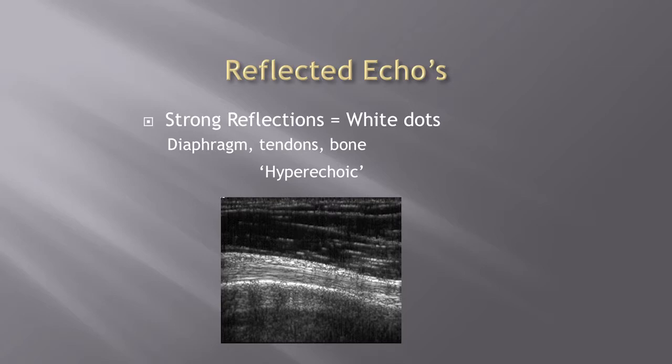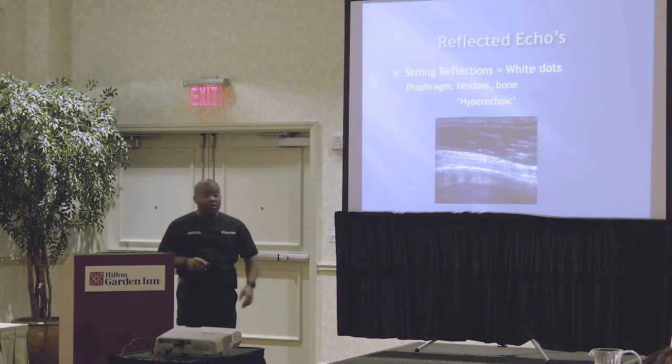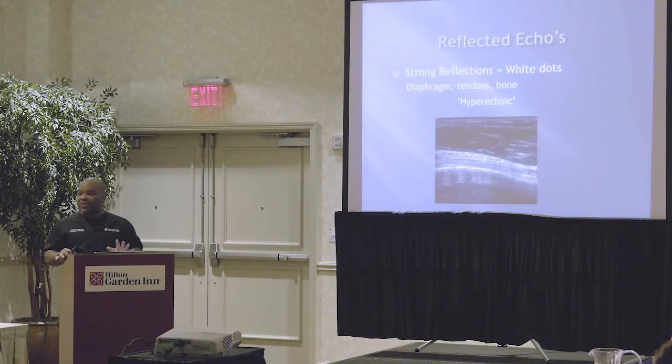There we are. So you have a little transducers here, got some skin there. Here's your tendon. And you go, well, how do I know it's a tendon? Well, one, I'm telling you it's a tendon. But two, a tendon basically looks like a busy day on the expressway. Lots of little cars. And imagine if you turn that up and make it go real fast, like cars are flying by you. That's what tendons look like. So there are your little cars there, all right? There's the outer sheet of the tendon there, and another one there, all right?